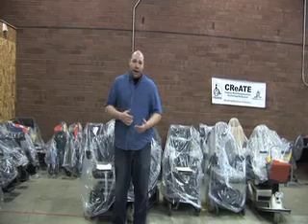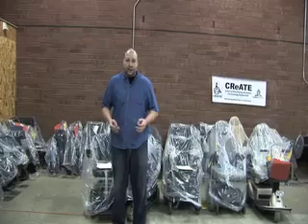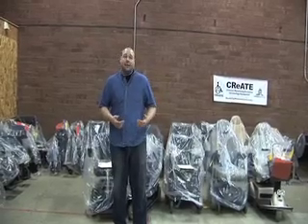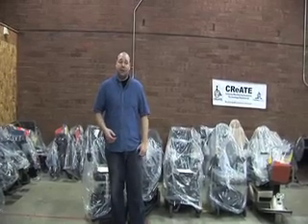The refurbishment process. Here at CReATE, we take chairs that are donated to us, and I break them down, clean them out, make sure everything's working on them, test everything, and reassemble them. I make sure everything's up to manufacturer standards and everything runs good before we do a transfer. Once I've finished with a chair and tested it twice, and everything is the way it should be, I sanitize it, and then we put it in plastic and wait until we get a call from someone who needs that particular chair.